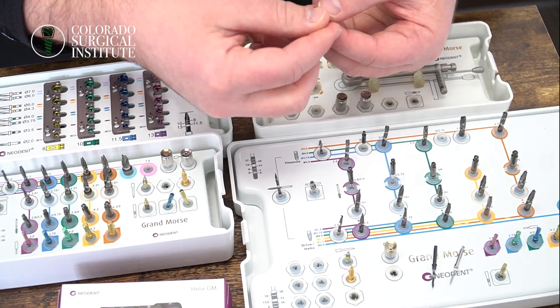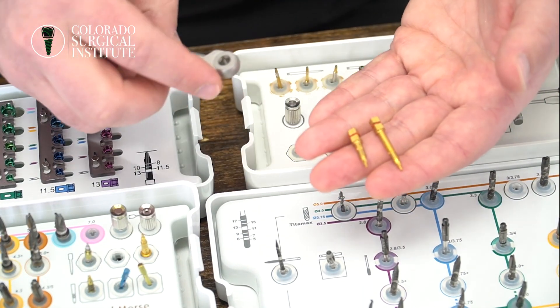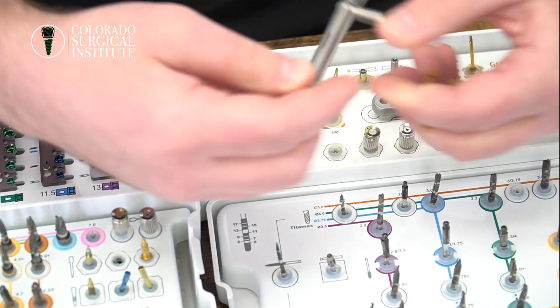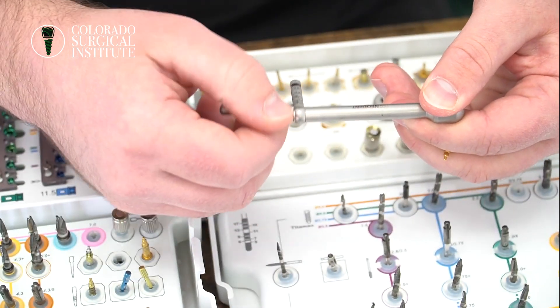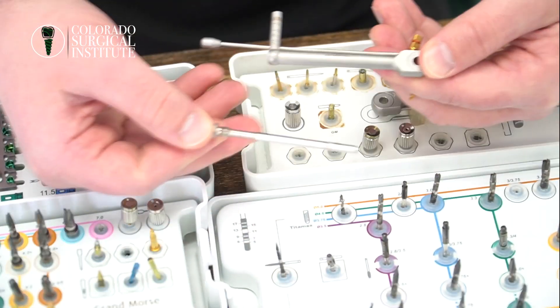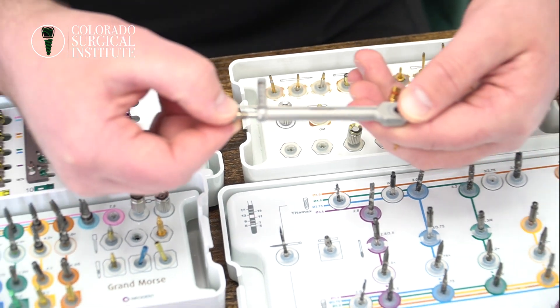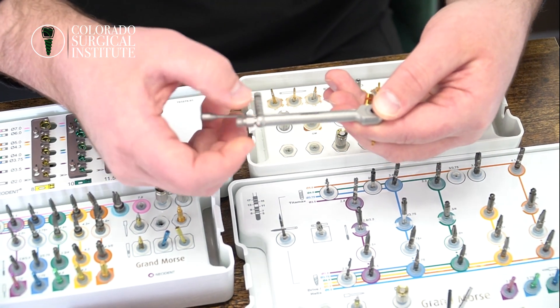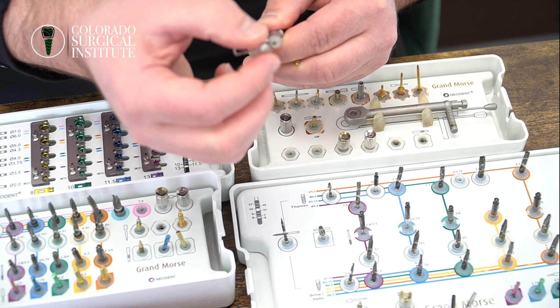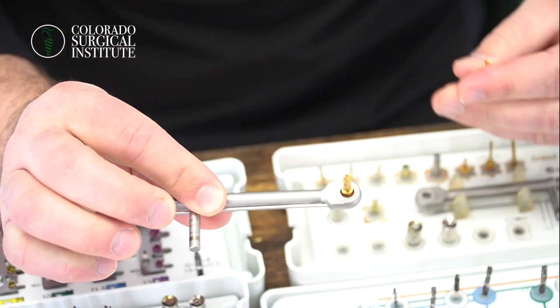We have two different implant carriers — a short and a tall. Sometimes in the posterior you're going to use the short one. These just go on the torque wrench. A tip when sterilizing: always take it apart because these are mechanical pieces. When it's not being used, take this piece out and keep it separate right underneath the kit. If you keep it attached the entire time, you can wear out some of the internal pieces and your torque measurements won't be as accurate. On the end you have a direction that goes towards you — meaning in — and away from you means out.